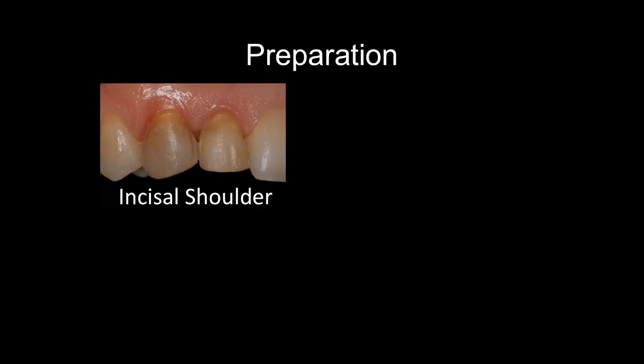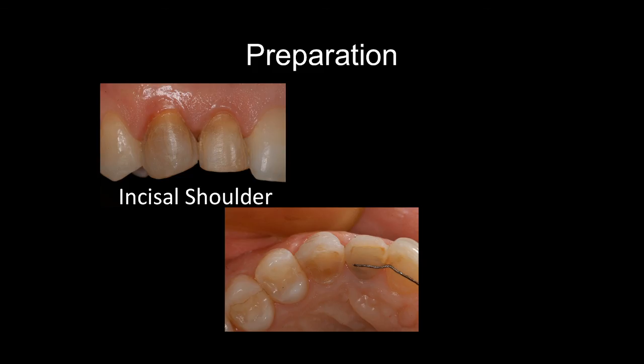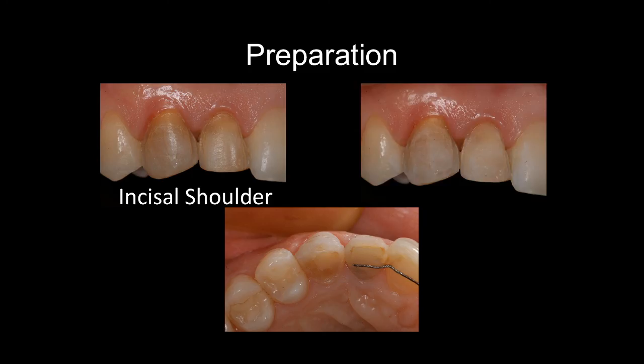will give us the possibility to bring the teeth palatally with a simple orthodontic appliance, a removable appliance. And a margin line was created just as a finish line for the lab technician. You see, the teeth are more palatal, and we have created the space for the veneers without touching the enamel, just a finish line for the ceramist to finish his preparation.